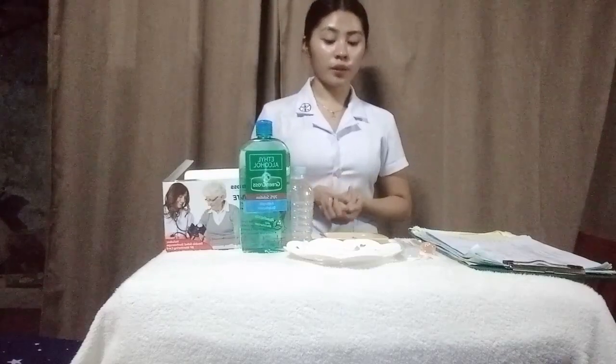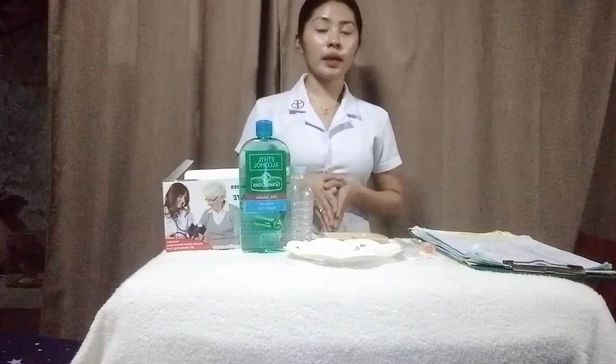I also have cotton balls. One is soaked in 70% alcohol and the other one is dry cotton. I have a hypodermic tray, and most important, I have a waste receptacle here, and this is where I will dispose of the used needles.